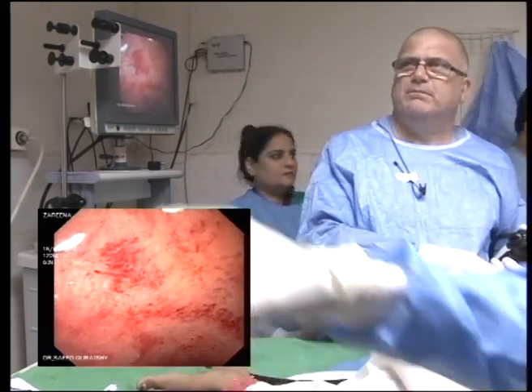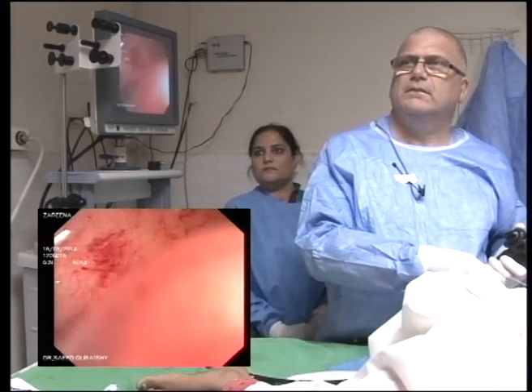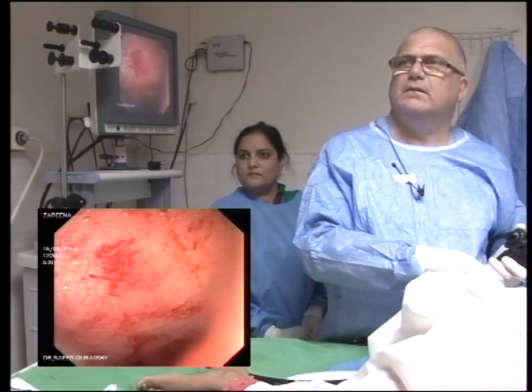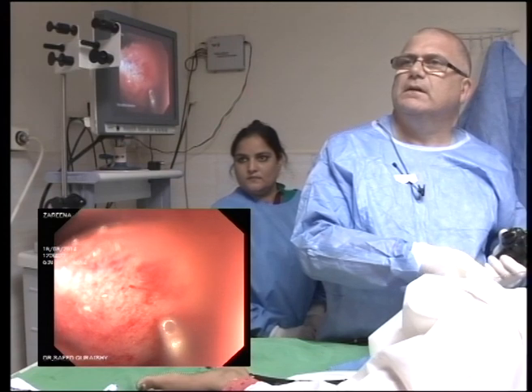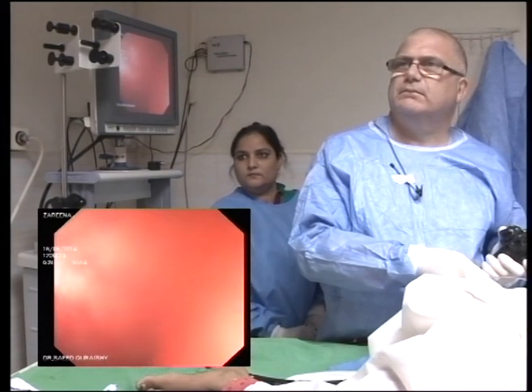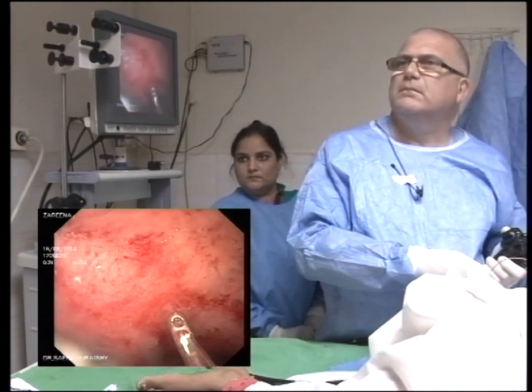Now I'm in the rectum. Let me just clarify this. What happened, the ileostomy was done some time ago. Today, the patient has come electively for this procedure, doesn't have any obstruction. What you're seeing is not a dilated colon. We can see it's not. And even the colitis is not too bad.